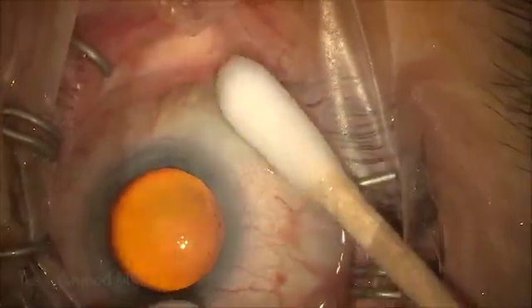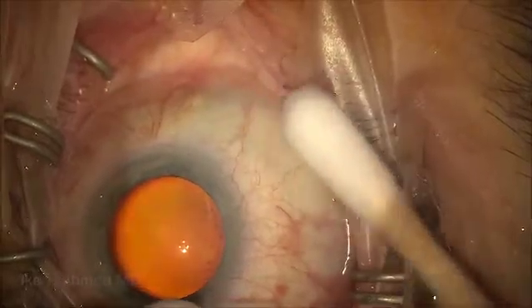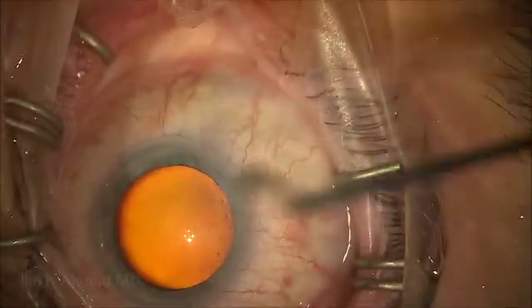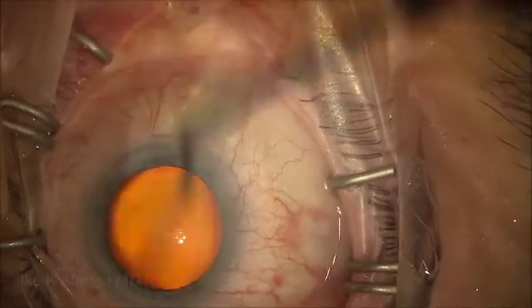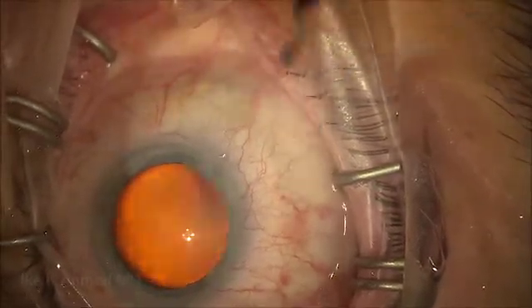Usually you wait about a minute or so prior to making incisions. Mitomycin binds fairly quickly, so there's really very little concern about entering the eye, although we do irrigate the surface of the eye to ensure there's no free mitomycin that may have leaked onto the surface prior to making incisions.